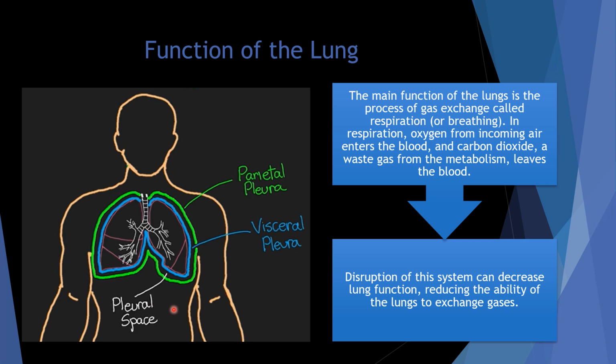And this is our area of focus when we talk about chest tubes, okay? It is our primary one, even though we will talk briefly about chest tubes in patients who have undergone coronary artery bypass grafting. Most of what we're going to be talking about is a disruption in that pleural space. And that disruption is what's going to cause a dysfunction in the gas exchange, right? So our pleural space is a very small space.